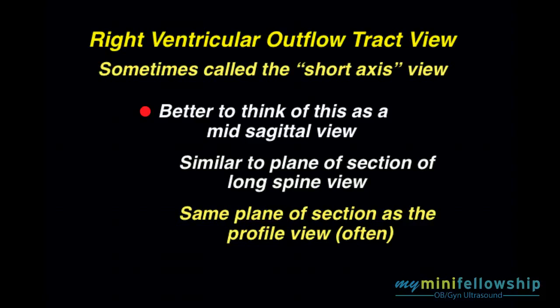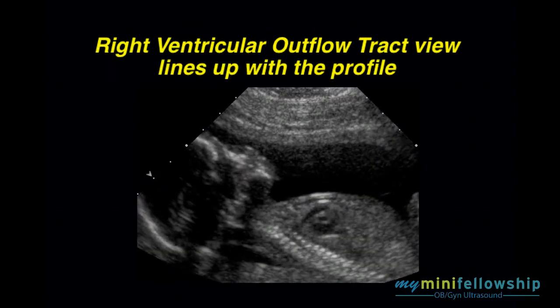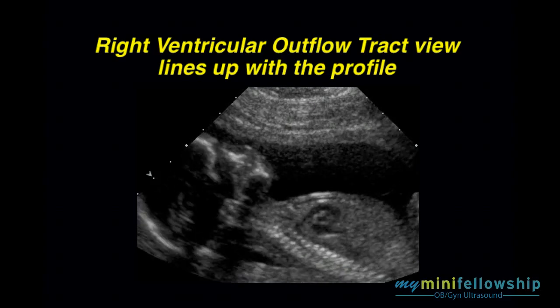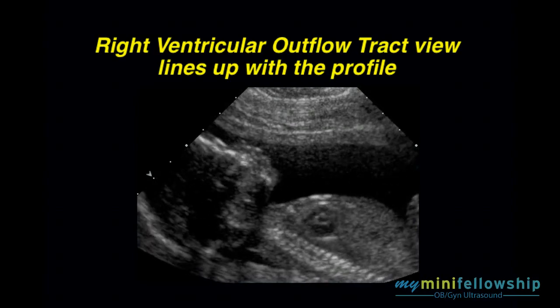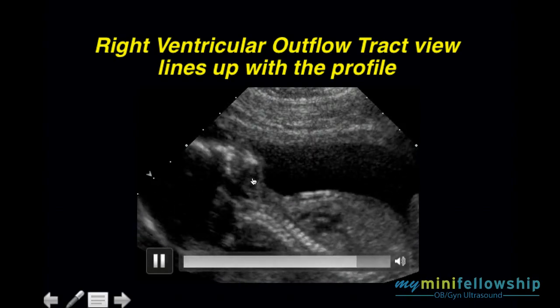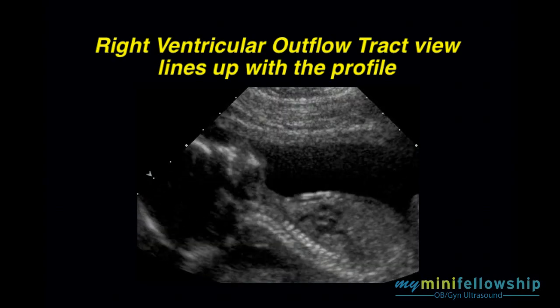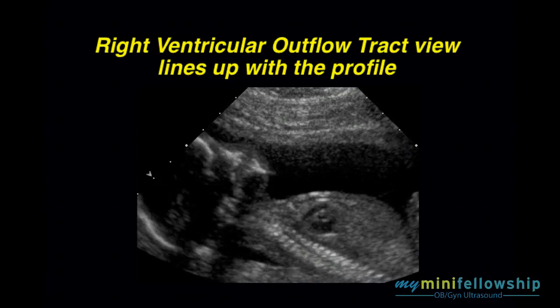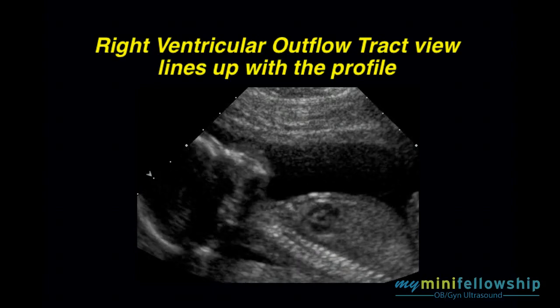The RVOT view is also often the same plane of section as the profile view. We're not required to get the profile view by the AIUM-ACR-ACOG guidelines. Nonetheless, every sonographer doing an obstetrical sonogram spends considerable time trying to get that profile view so that the mother can bond with the fetus — and that's a great idea. But for the radiology and obstetrical groups watching this lecture, notice that we also get a very nice RVOT view at that time. Every time you get an opportunity to evaluate the great arteries and the heart, take that opportunity.